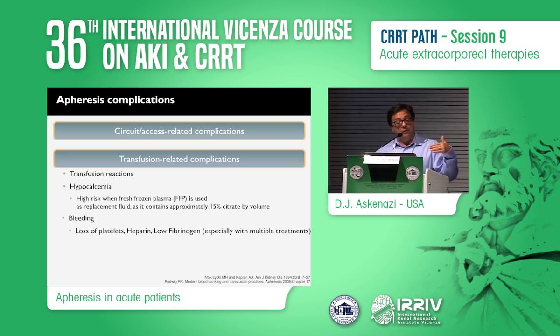And so if you're going to be doing plasmapheresis, and especially if you're going to do it on a daily basis, you're going to end up really depleting your coagulation factors unless you're replacing them with plasma. I'm going to talk a little bit more about the decisions between how to choose whether you should use albumin versus plasma coming forward, but it's important to recognize that if you're not using plasma and you're doing multiple episodes with just albumin, you run the risk of having bleeding problems.